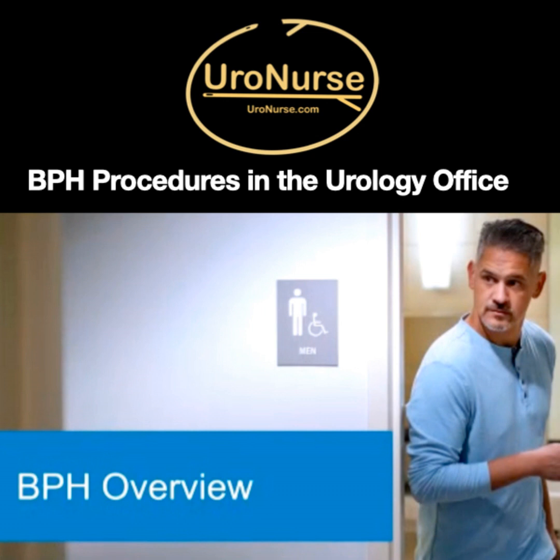Putting them back on an alpha blocker, some of the patients are going to need it. Now, some of the time it's because the procedure itself wasn't potent enough, and some of the times it's a patient with a hypertonic bladder and you've opened things up just enough with the Rezum to get them going again, but they may need to stay on both. And sometimes I think it's a little unfair to consider somebody a failure if they're still on the Flomax.